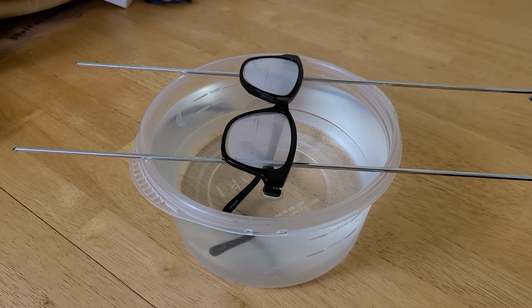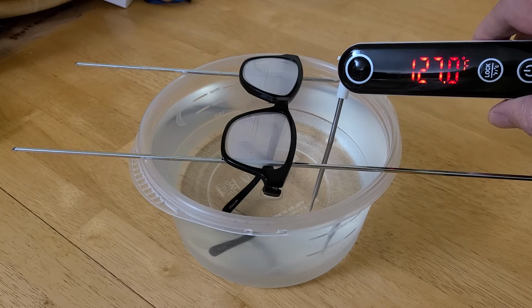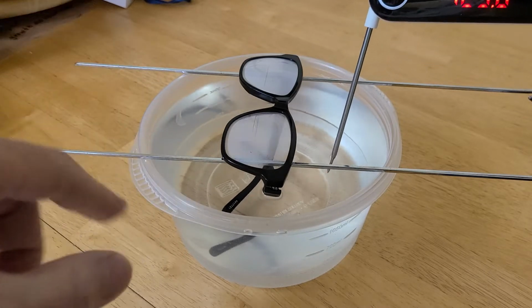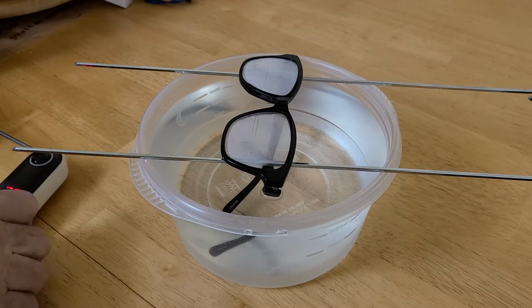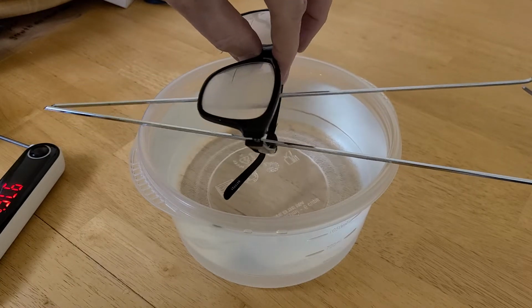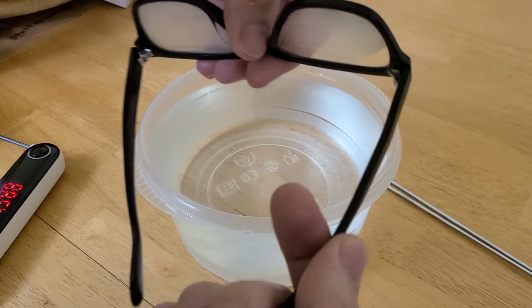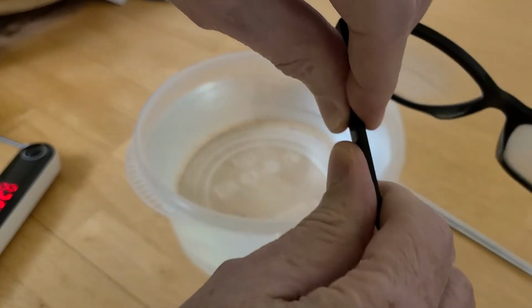Okay, so I've had my acetate frames sitting in warm water, so near 130 degrees, so I can hold my finger in there, but it's pretty warm. Suspended on these skewers. So now I'm going to see if I can bend these a little bit. They need to just bend outward a little bit.